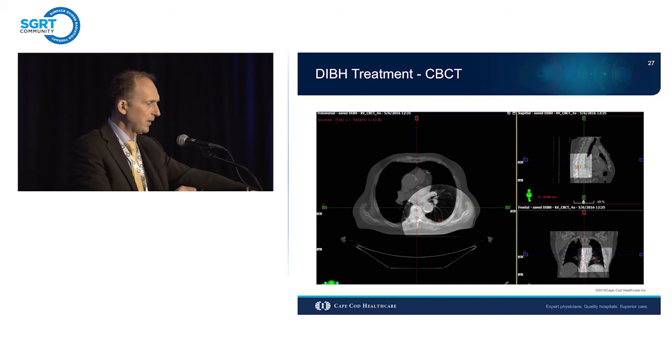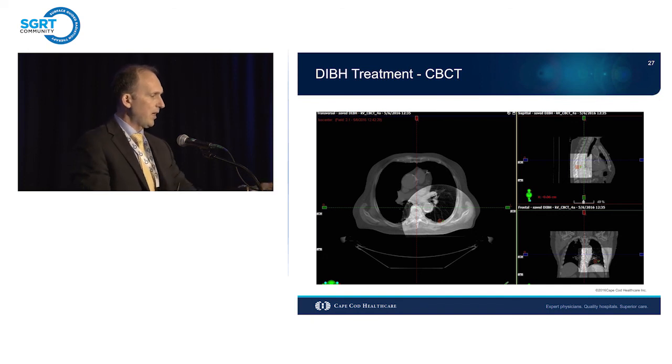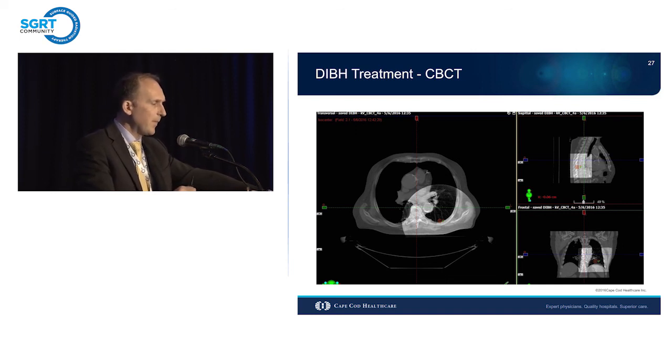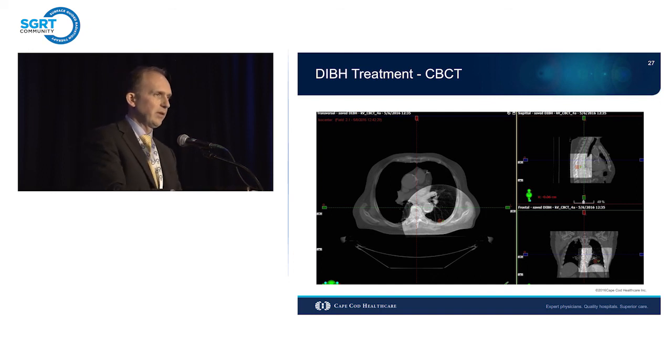So here's the cone beam CT that I mentioned. If you capture a full trajectory cone beam CT, you have the whole body, of course. If you do a half, this is what you get. Is it enough information? I think it is. You have some bone, some ribs, some spine, some soft tissue. You certainly have the lesion, obviously, in the center there. So we are trying to utilize this more and more often, because doing the full cone beam CT for breath hold patients, when you have to interrupt the cone beam CT halfway, and chances are you're blocking cameras all the time, is very difficult.